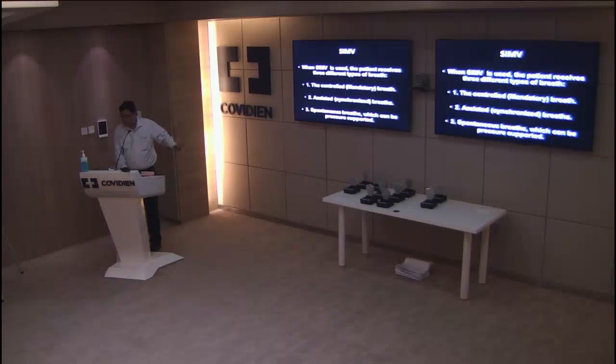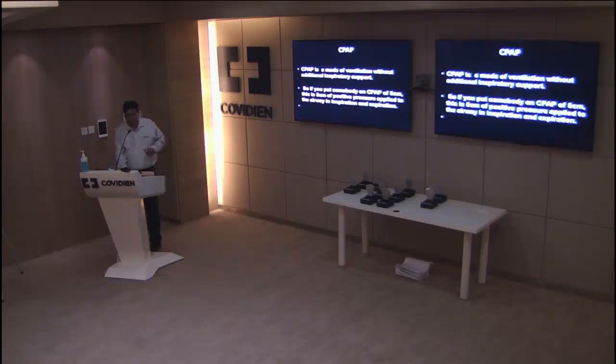All this is really theory, but by and large, like I said, keep it simple. You really don't need to use SIMV. You can use pressure support, pressure control, volume control. These are all modes that you need to know about in theory for your exams, etc. In actual life, you really don't need all these things. Now, CPAP is another mode, again a spontaneous breathing mode. CPAP is a spontaneously breathing mode.